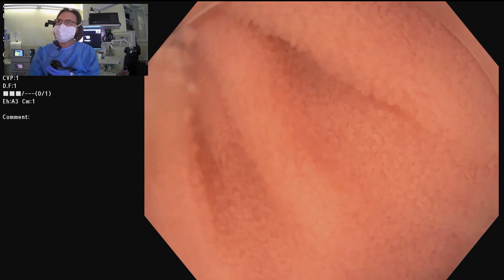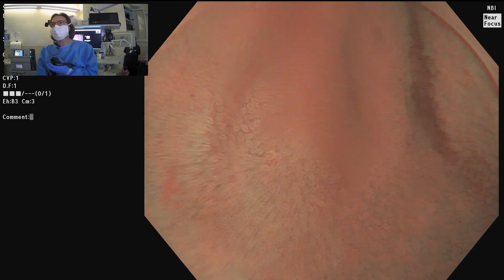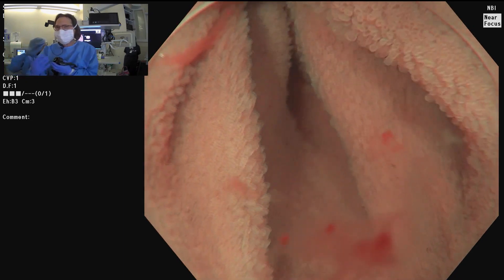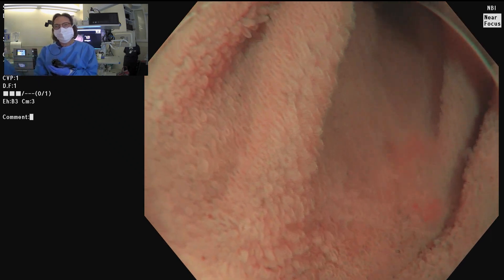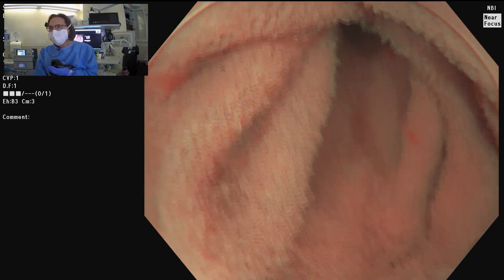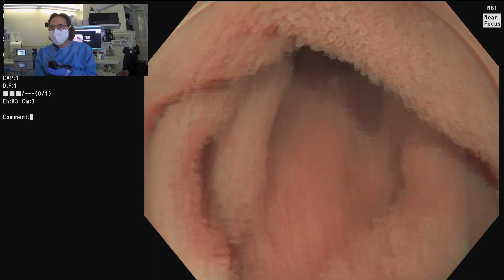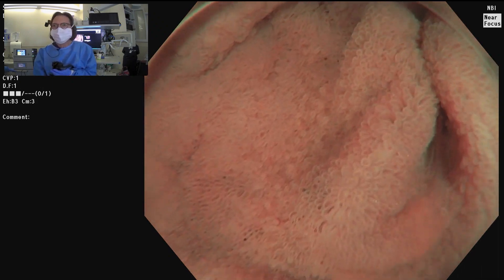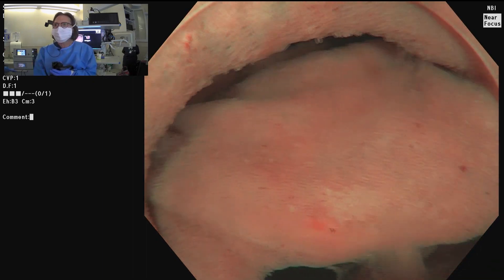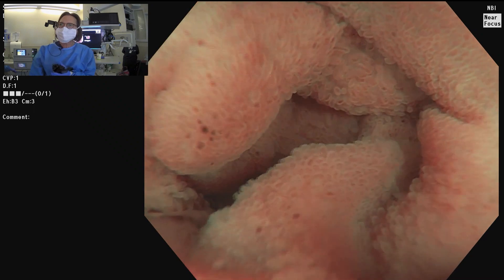Coming back with NBI — I just love these views. What makes the underwater technique appealing is just the views. It's like going snorkeling or scuba diving. It's not just the 1.33-fold magnification effect; you also have no light reflection artifact, no fogging, none of the artifact you get with gas insufflation. And if you use cautery, you don't get any smoke effect. These are all advantages of taking advantage of water submersion when you do these procedures.